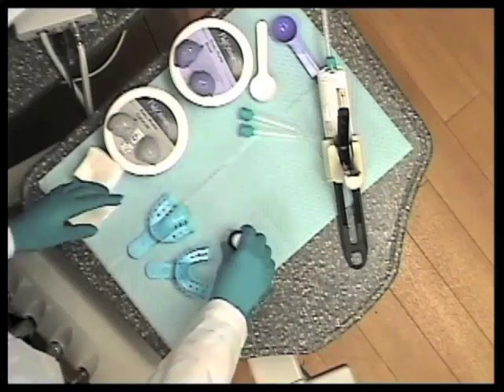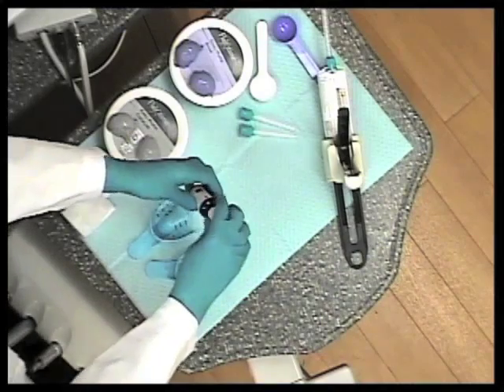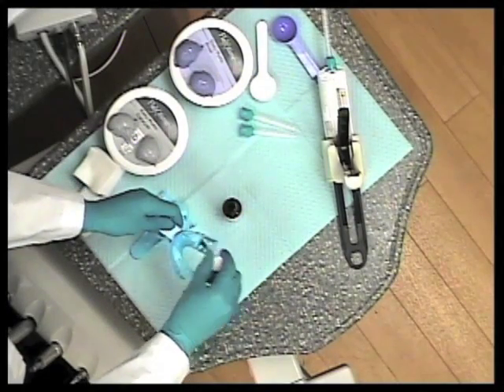So what I want to do is just show again how Mariah does this in our practice and how we get clean impressions, and really show you how easy this is. The first thing we're going to do is just begin by using an adhesive on these trays. And so, just a plastic tray works very, very nicely.